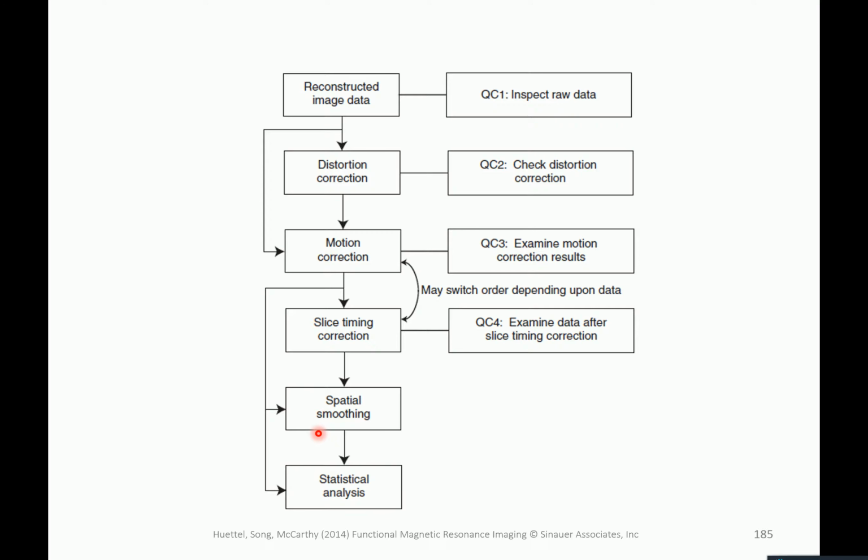What this is mainly trying to indicate is that there's a number of pre-processing or processing steps between the data that you get from the scanner and the data that you then apply, for example, your classifier to, your GLM to, your DCM to, or your own model that you developed yourself because you're a real scientist and not just a toolbox using clicking monkey. And monkeys are nice, nothing against monkeys, but this is sometimes in labs kind of how things are. So you should aim for actually developing your own models and not use the models that other people have proposed. But if you want to do that, you should also, of course, know what other people have proposed and understand the models that other people have proposed.